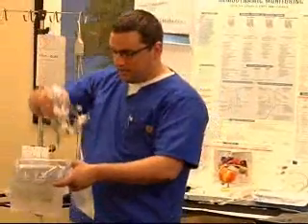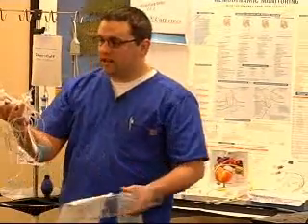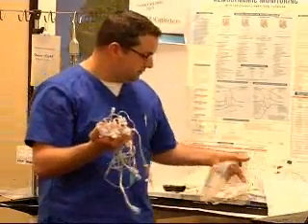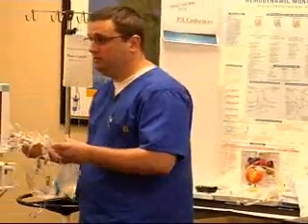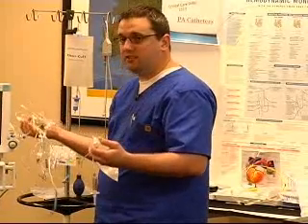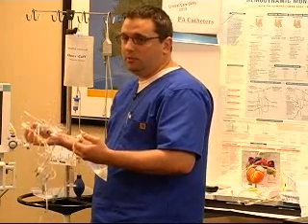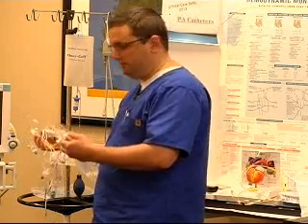It has that nice little paper banding that everybody loves. There's actually a reason for that. It's to keep it off the floor. So if you remember that and you don't break them initially, it actually will make it easier for you to keep up with your lines if you're priming them ahead of time. That way they don't just arbitrarily fall off and hit the floor.